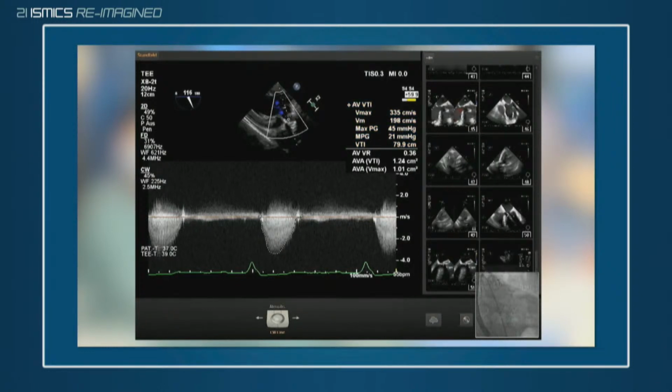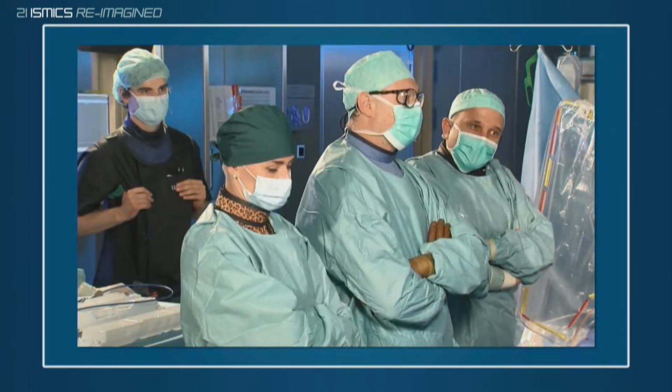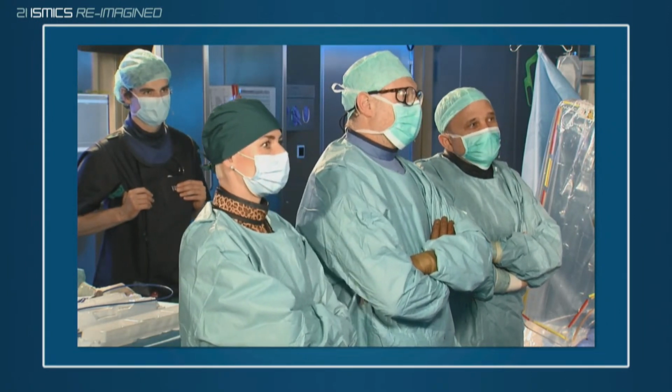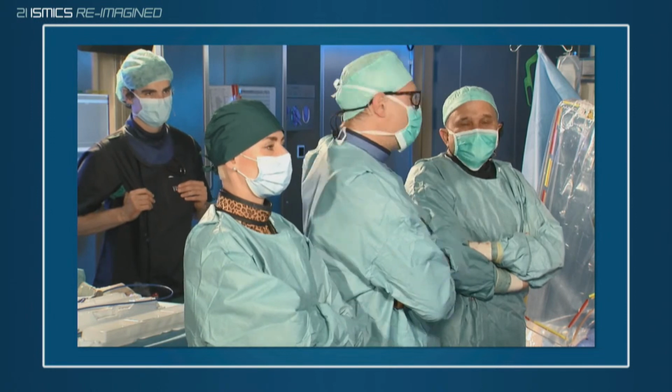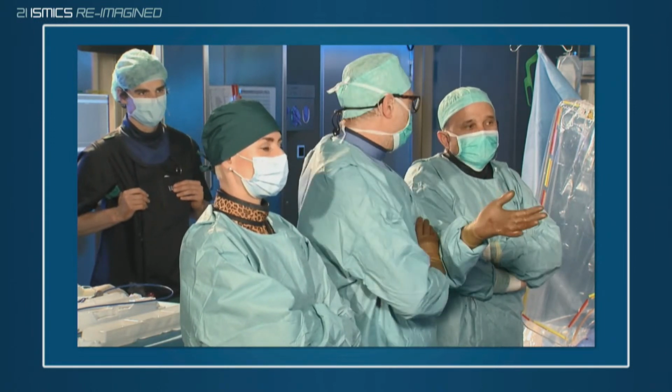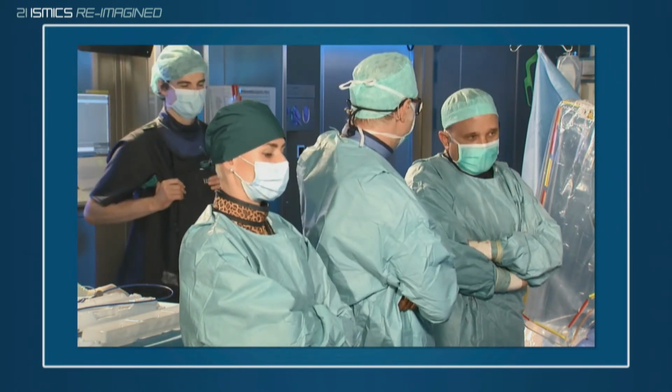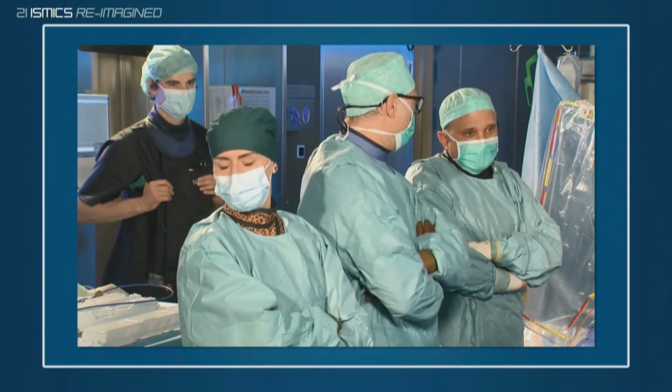And valve area increased to 1.2. But the question is, should we use balloon dilation and possibly fracture? Very difficult. I mean, she's 81. I think there are good arguments to just leave it like it is and not do anything.